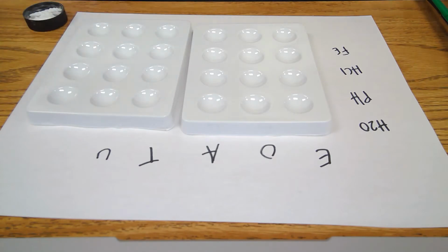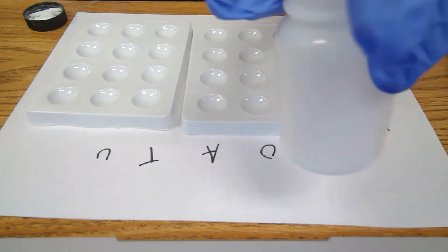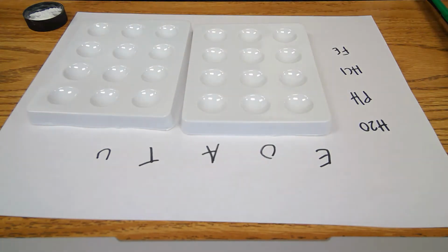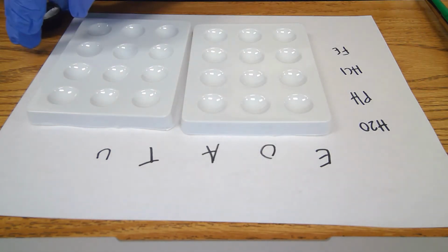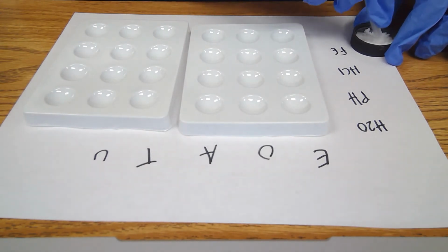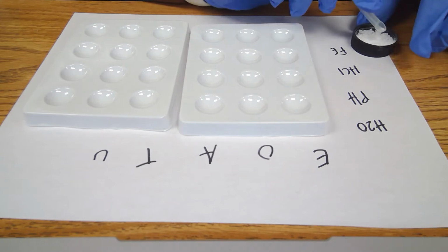Okay, so from here we'll start inserting our drugs. We'll start with ecstasy, and you're going to put a little bit into the cap. That makes it easier. Then you're going to take your tiny scoop. You might have to break it up and mix it up to loosen the clumps a little bit on some of these, and that's what I'm doing here.